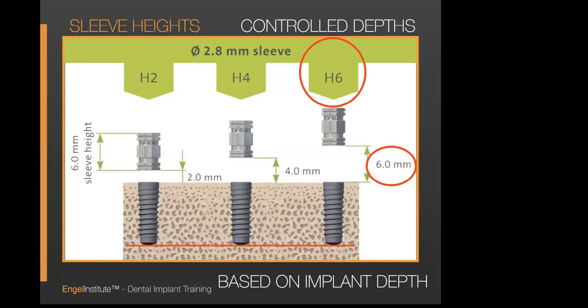So let me make this more clear. You put the implant in virtually, and the machine's objective and the objective of the doctor at 3D Diagnostics who's helping you design this is to put whatever implant you think is the best implant, safe and sound, in there. Then they're going to work up. They're going to give you the shortest handle. They're going to give you the shortest distance from the sleeve. They're going to compress that as much as they can. Why? To make your life easier. So when you have a 26 millimeter drill in your hand, you can get to number 18.